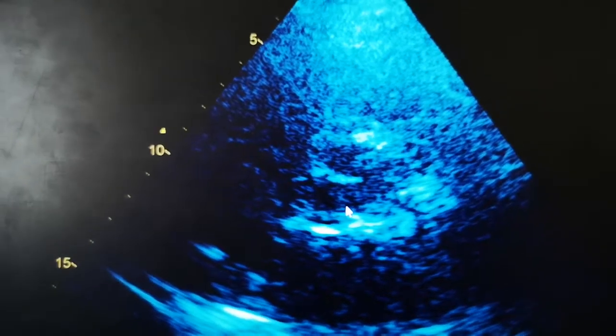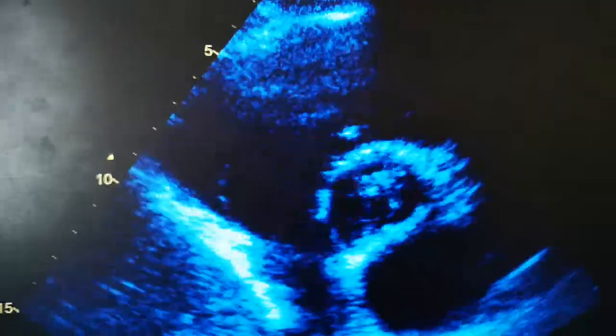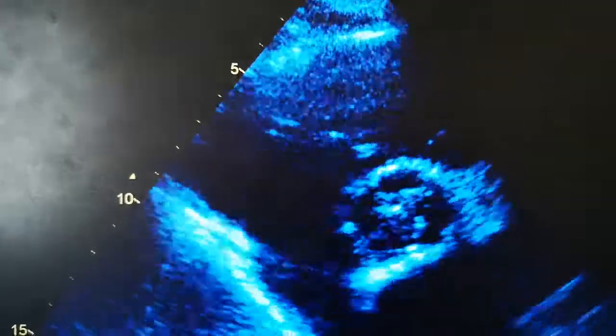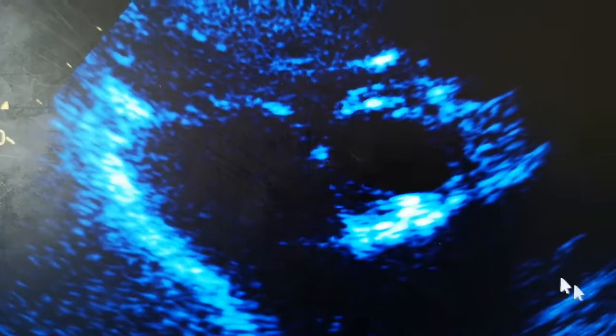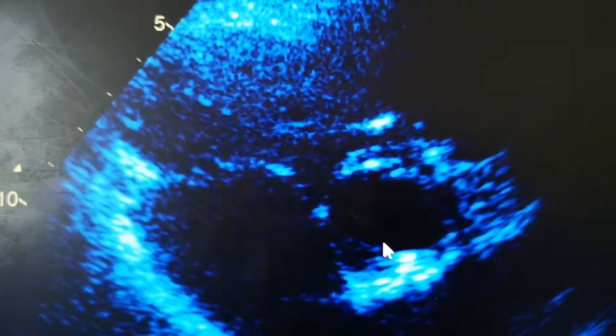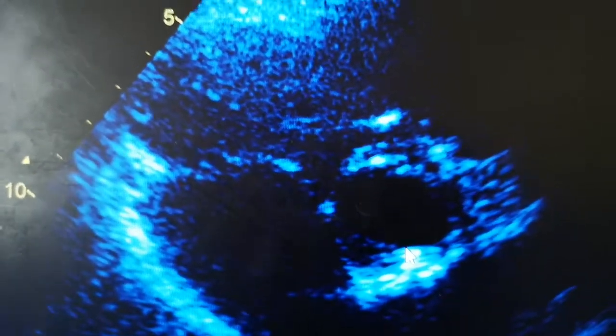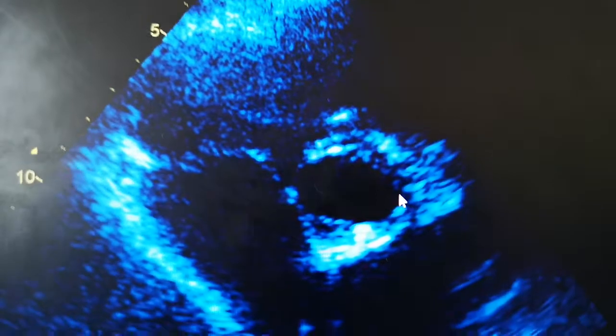Now let's go back to our bicuspid aortic valve in systole. Unlike the three cusps we saw in the normal valve, you can clearly see one cusp here and another one coming — just two. It looks like a mitral valve compared to a tricuspid aortic valve.